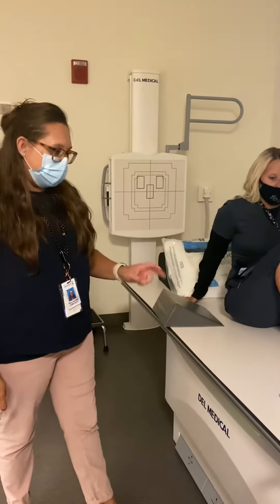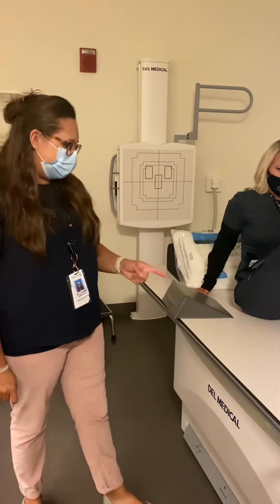We'll do the ankle for this one. So the ankle, we're going to do three views: AP, Mortise, and the lateral view.